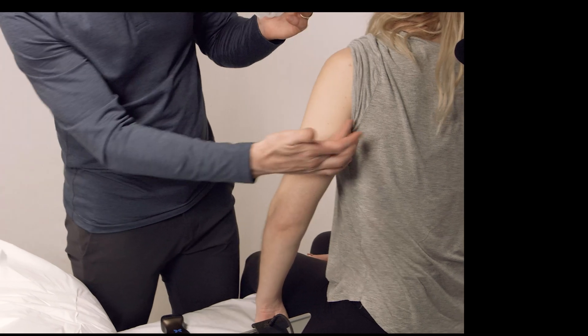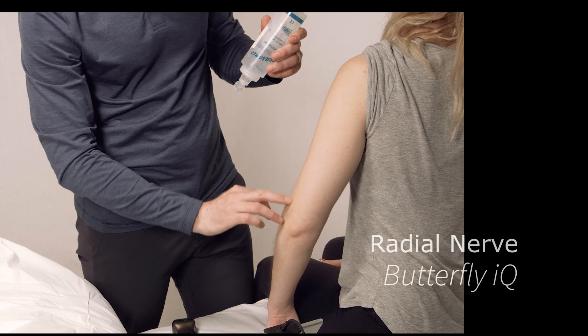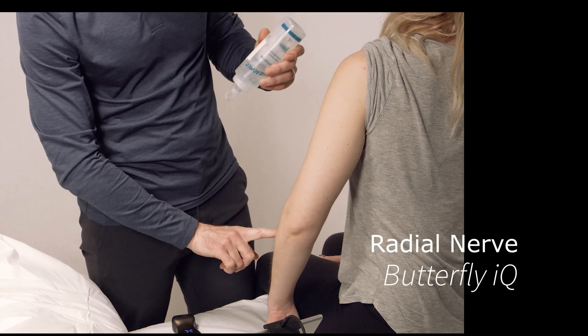This video is an introduction to the radial nerve. I'm using the butterfly probe and I'm also going to make a video using a different ultrasound machine just for comparison.